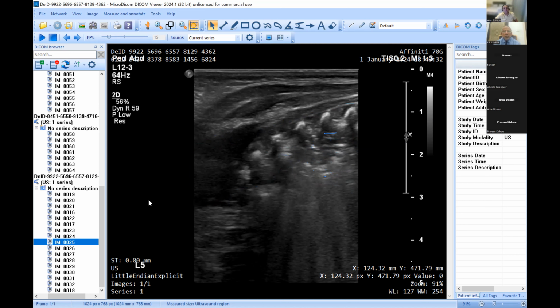Clinically, what I'd say is that babies who are nursed supine, that's why it's really important to move them. And it might just be that keeping this baby prone over a period of time will help this lung recruit, because if your gas exchange is okay and the baby doesn't have much work of breathing, then clinically my advice would be there's nothing that needs to be done. This is about positioning, good care, growth.